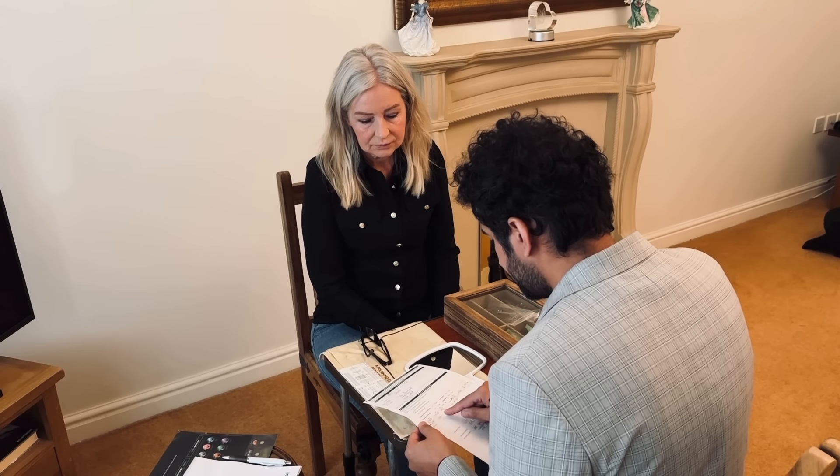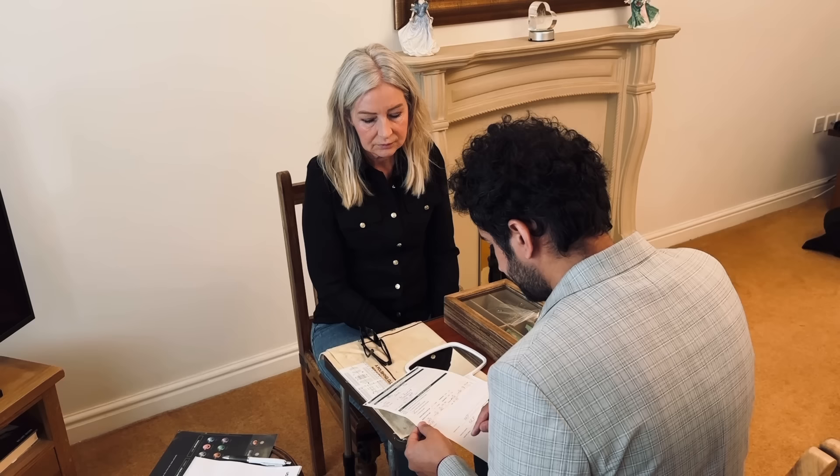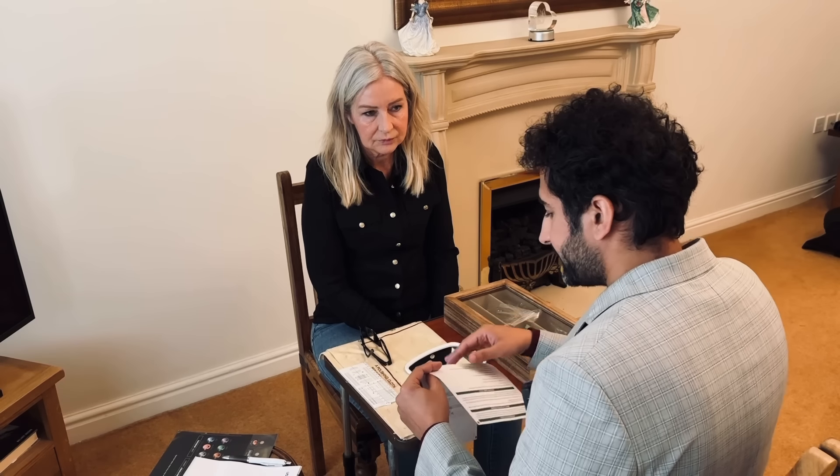So just look in, there's a little bit of distance, not much. Reading addition 175, that's fine. So I'm going to put that there, that's yours to keep. Okay, all right, we don't need that.